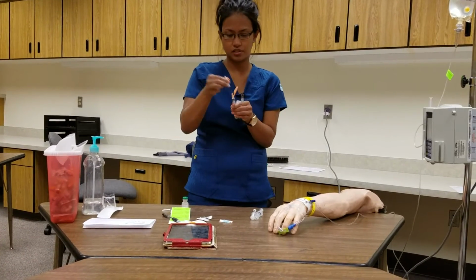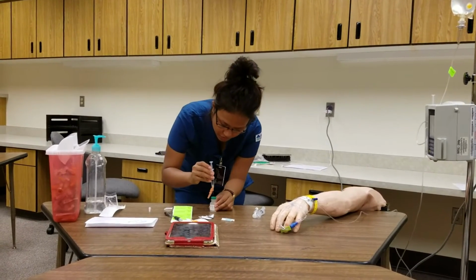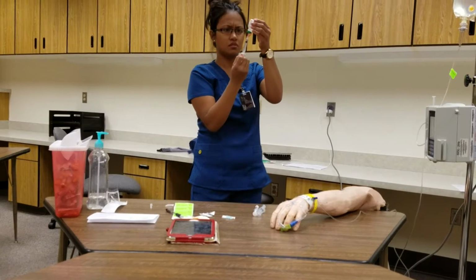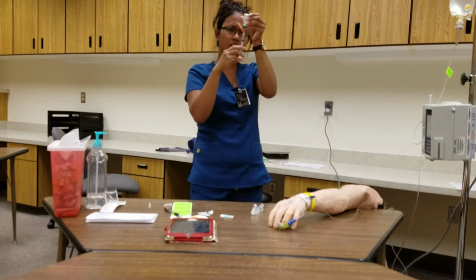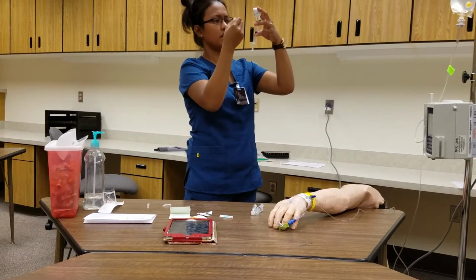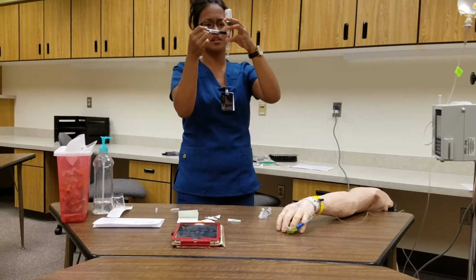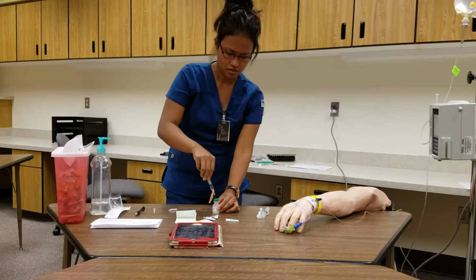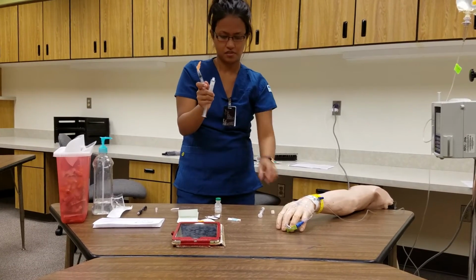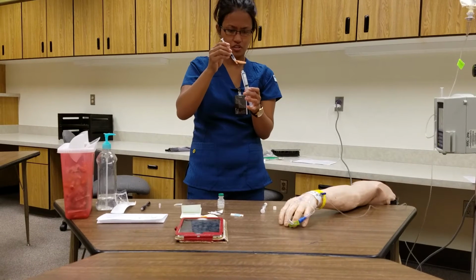What I want to do is draw in 1 ml of air, and now I will be putting 1 ml of air right there, making sure there are no bubbles. If I see that there are no more bubbles, I'll be getting my sodium chloride. I'm at the med room right now, so it's just me. You just make sure to prime it. Okay, there's no more air, and now we'll be injecting this one.